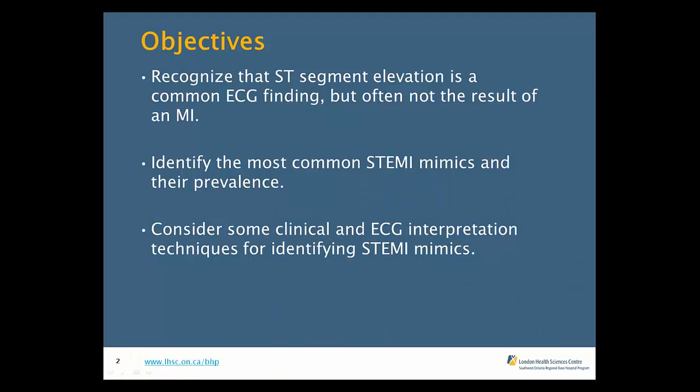Okay, so our objectives for the next few minutes: we're going to spend a few minutes talking about ST segment elevation in the setting of both STEMIs and, more importantly for this presentation, mimics. The interesting thing is that STEMI is actually not the most common cause of elevation, so that's what we're going to spend some time talking about now. Most importantly, hopefully the take-home information will be to provide some tips and tricks on how to clinically apply this to help paramedics improve their accuracy in differentiating mimics from true STEMI.